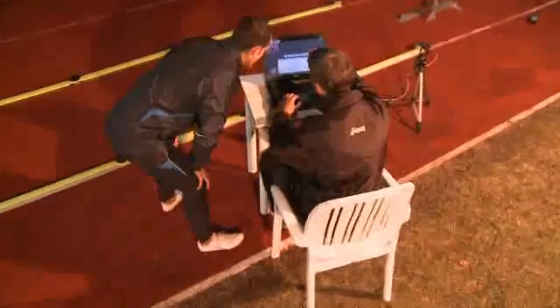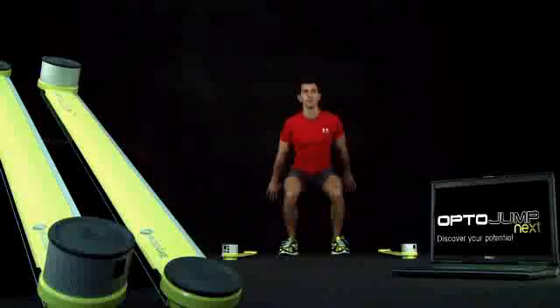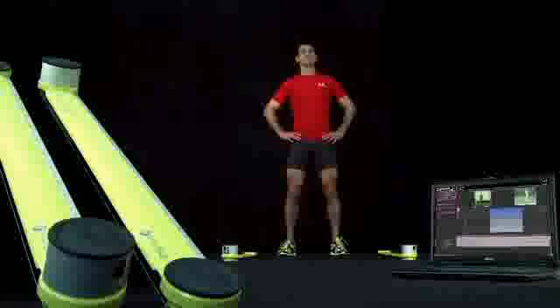In the single meter configuration, OptoJump Next allows users to perform jump, reaction, and running tests when mounted on a treadmill. This configuration can measure contact time, flight time, reaction time to visual and acoustic signals, barycentric height, specific power, frequency, and dissipated energy.